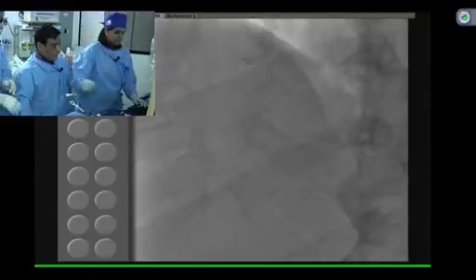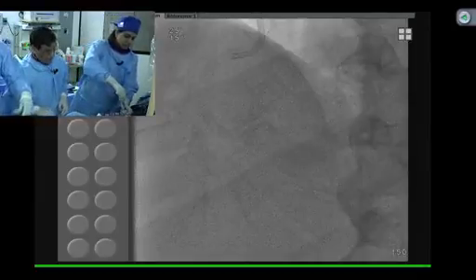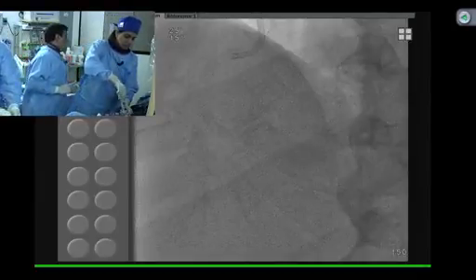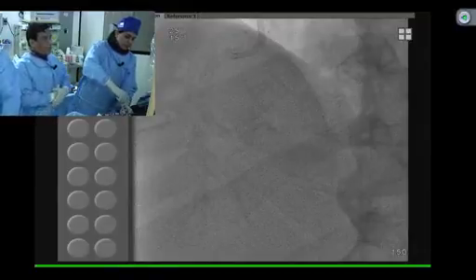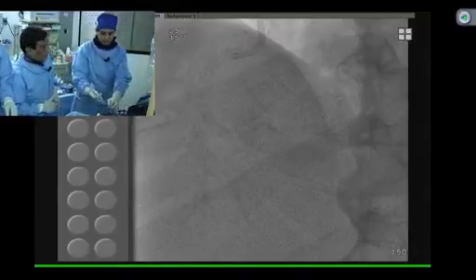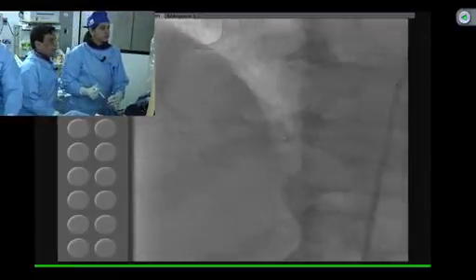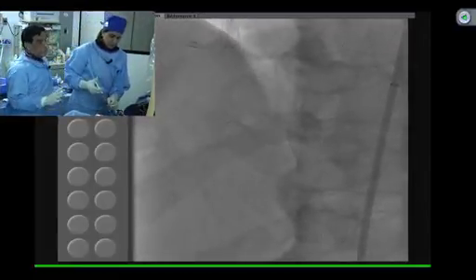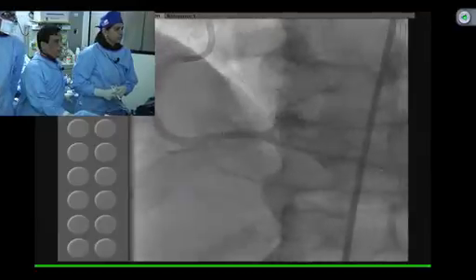I think we can take everything out and take a last picture. Did you notice there was a little waist that took a while to go in the very proximal segment? Absolutely. And this is what rotational atherectomy requires, that you don't have to go to those crazy pressures and worry about the stent expansion. So with a combination of the rotablation and high pressure balloon, we got these results which are just coming up here.